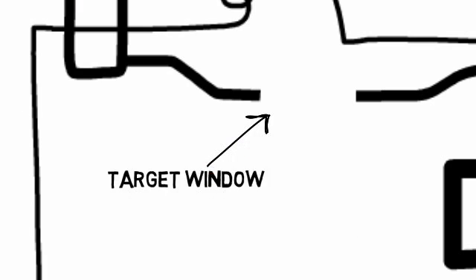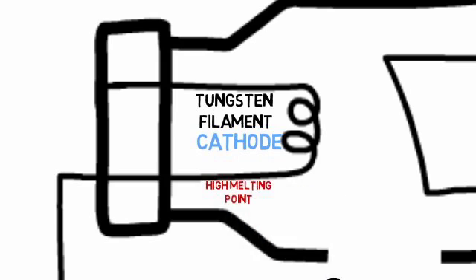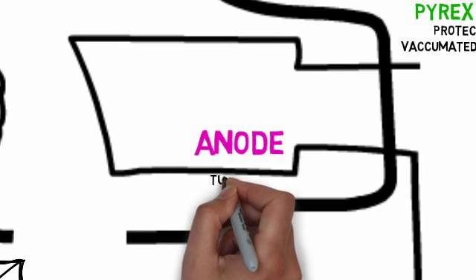The glass has a target window which is a thinning of the glass. The cathode is made up of tungsten filament and has high melting point. The anode is also made up of tungsten.